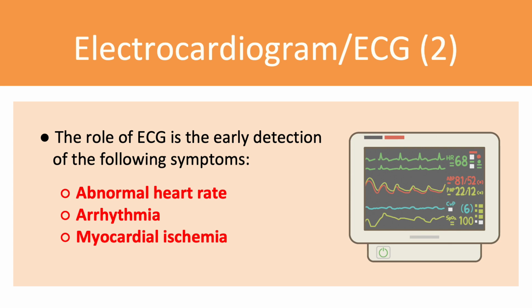The role of an ECG monitor is the early detection of abnormal heart rate, arrhythmia, and myocardial ischemia.